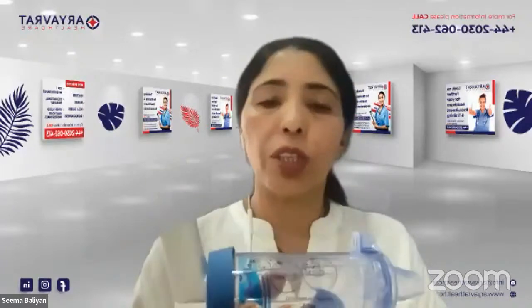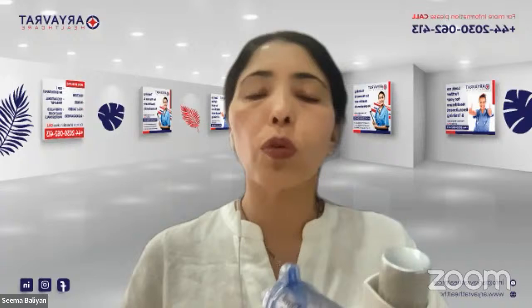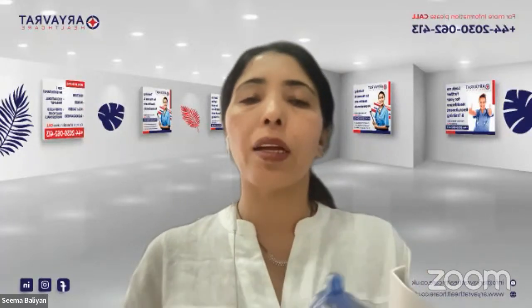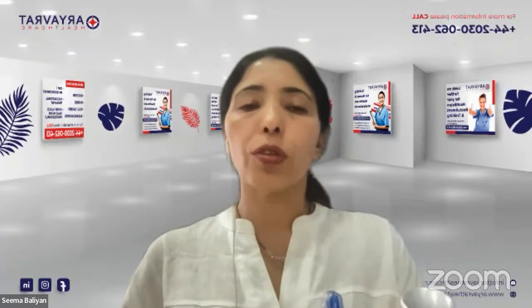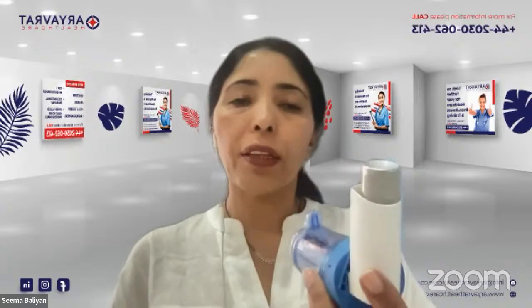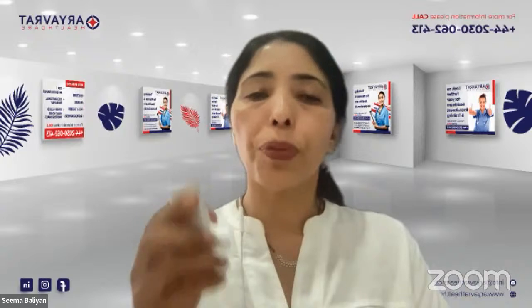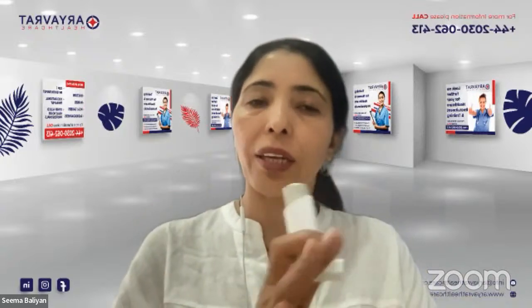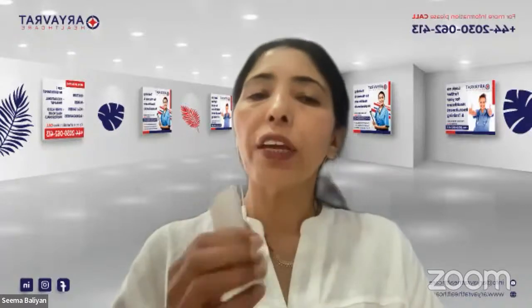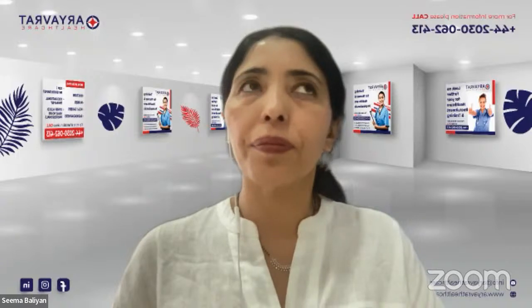Now coming to the position. The position for you to take the inhaler is going to be the same as what we did for peak flow. So we are going to sit or stand in an upright position, making sure that the neck is in the neutral position. Once we have done that, we come to the procedure. Now in the procedure, we have already checked the 5 R's of the medication. Now, before we give the medicine to the patient, what is the other thing that you will need to check?